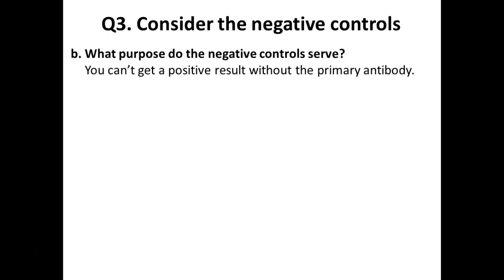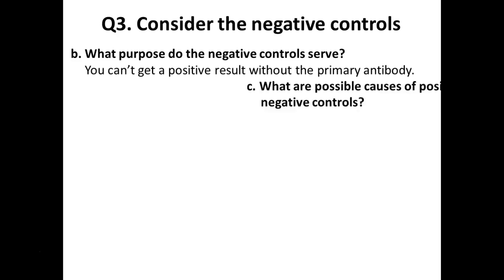Yeah, you could do it on water, right? Water should not give you a positive pregnancy test. If it does, then we got some contaminated water, right? Exactly. Yeah, they always say it's the water, right?